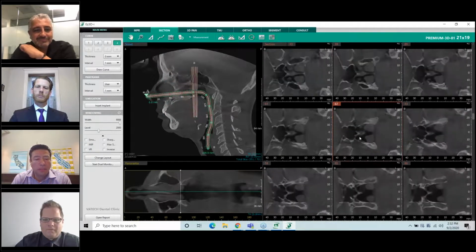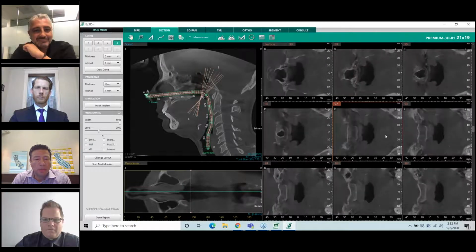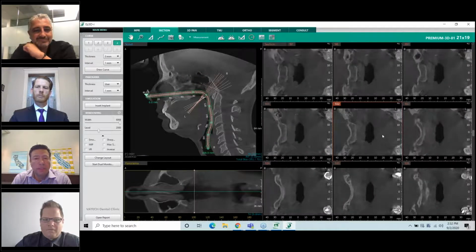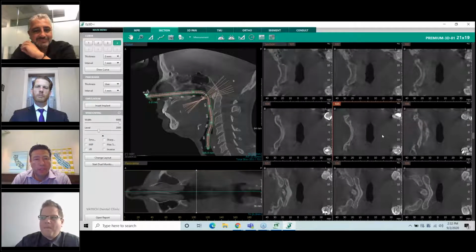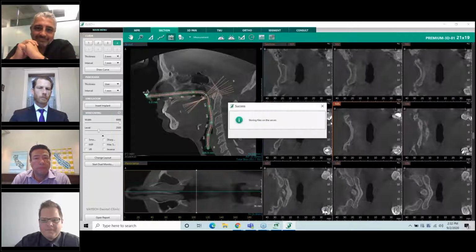While using this tool, you're basically doing what we call a virtual endoscopy, because you don't have to probe the patient with this foreign object. If you've ever had it done, it's very uncomfortable. And it gives you similar, if not more powerful data than what you would get with that intraoral camera. Absolutely.